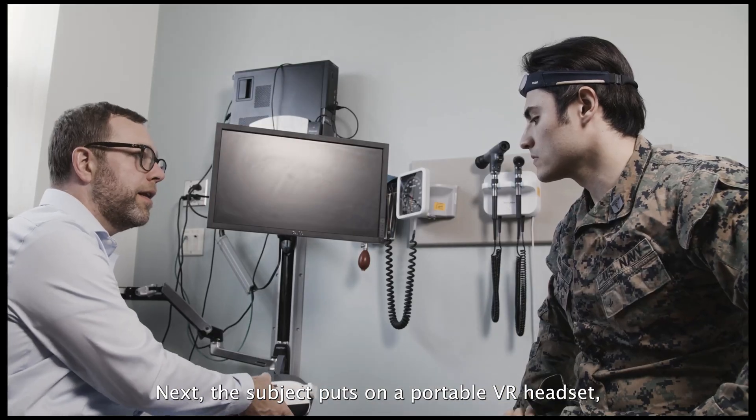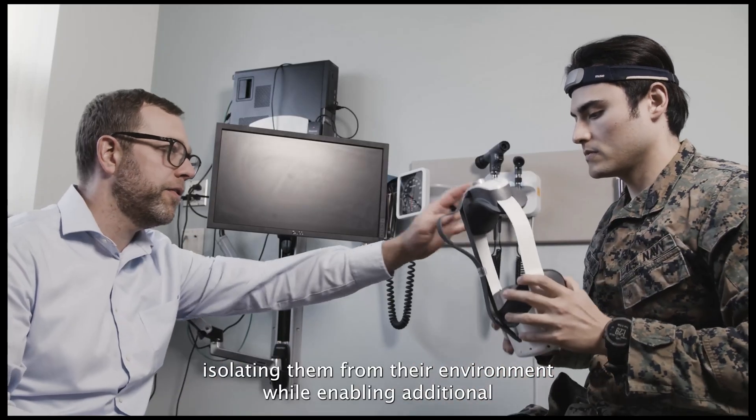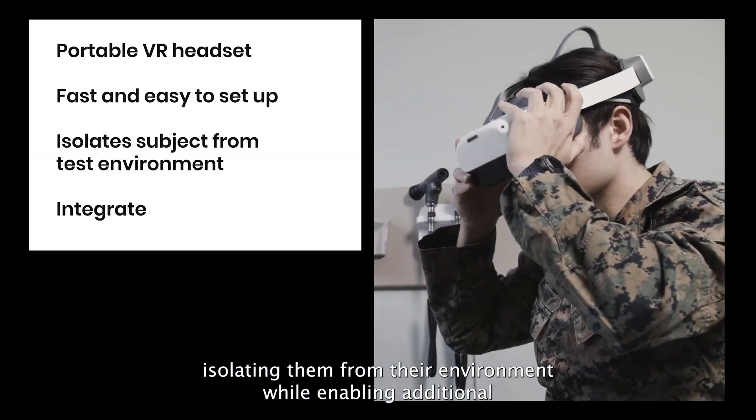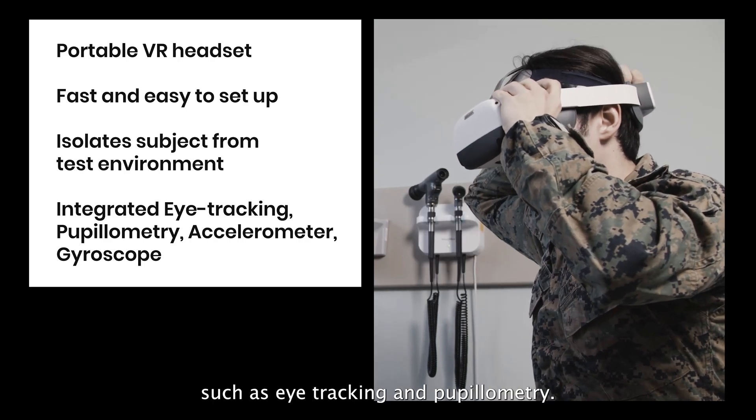Next, the subject puts on a portable VR headset, isolating them from their environment while enabling additional physiological sensing inputs such as eye tracking and pupilometry.